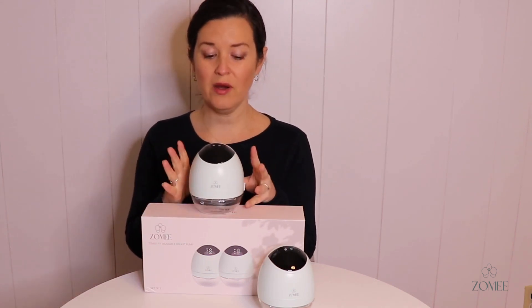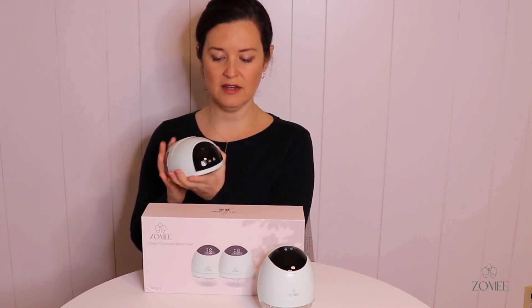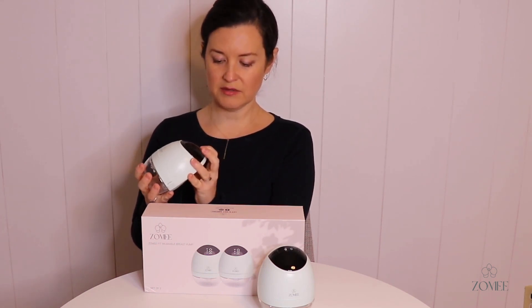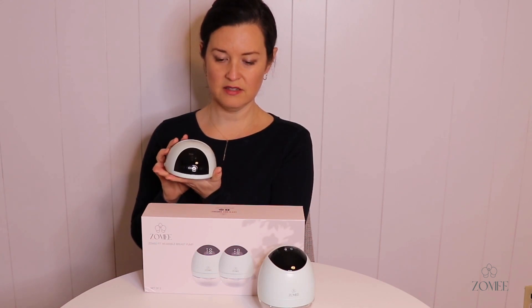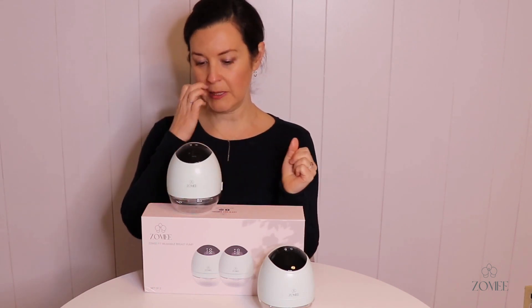Each of those phases has nine levels of suction, making it highly customizable. The pump is pretty quiet — you hit the on button first, then pick which phase or mode you want, and hit on again. This is level six in the stimulation phase — you can hear what that sounds like. Switching to the expression phase, that's what the pump will sound like when you're using it.